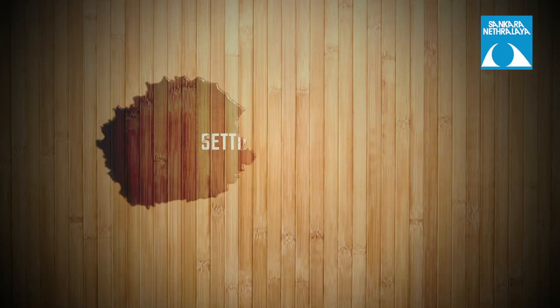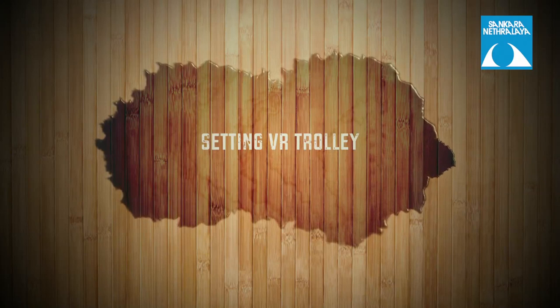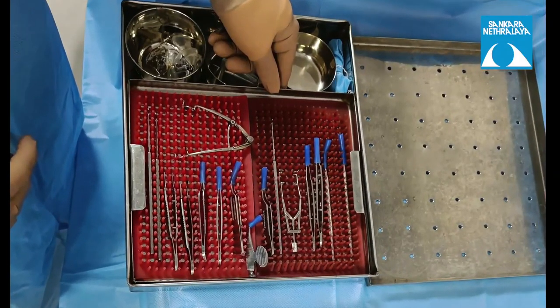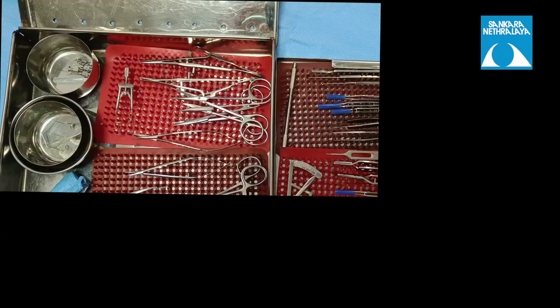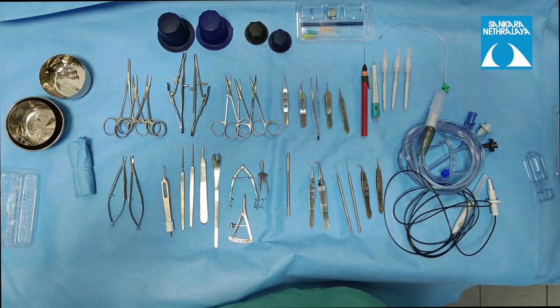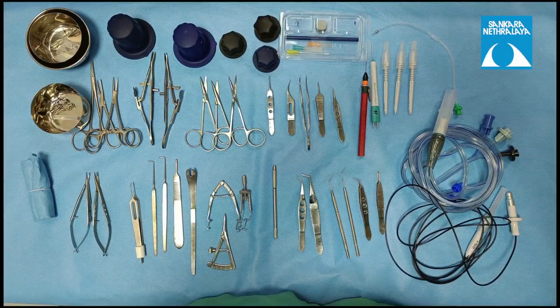Preparation for setting up the VR trolley begins a day before, when the instruments are cleaned, packed, and sent for sterilization. One should be well aware of all instruments packed in the tray so that only the particular set needed may be opened on the day of surgery. The sterilization sticker inside the tray must be checked. The instrument tray is opened on the trolley with a sterile sheet and adequately placed for faster handling during surgery.